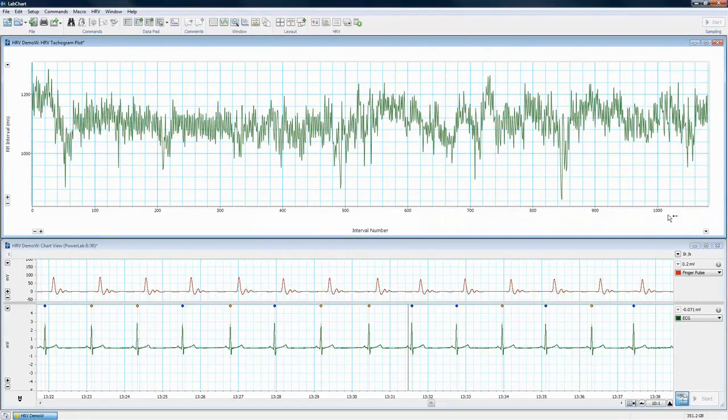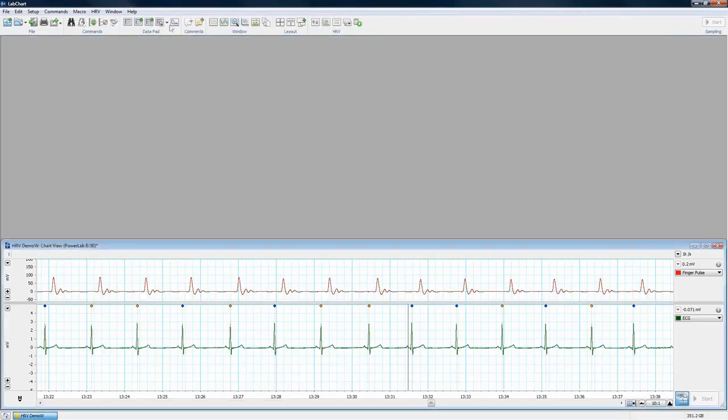What is it good for? The tachogram shows the instantaneous variation in heart rate, and it can be a good identification of misidentified R waves, as they'll appear as sudden dips. These are probably okay, but if you have this huge spike that goes to an extremely small RR interval here, or a really large one, you might want to take a look at your detection to see what's going on. You may have to tweak your detection settings or actually delete a marker there to make things align and to do proper analysis. Also, you can get to the list from here.